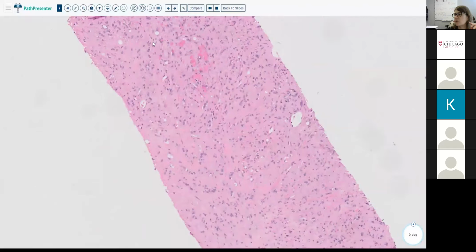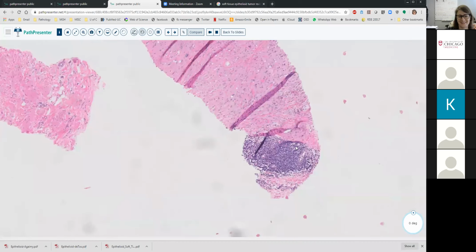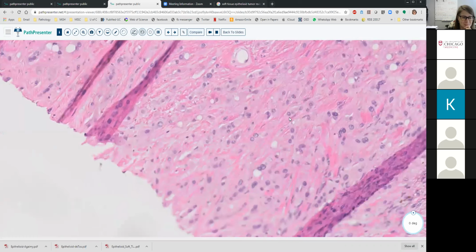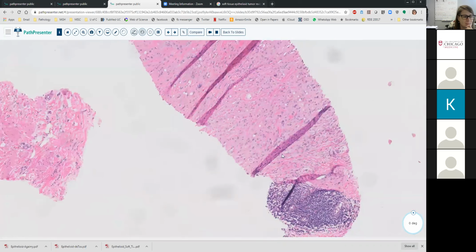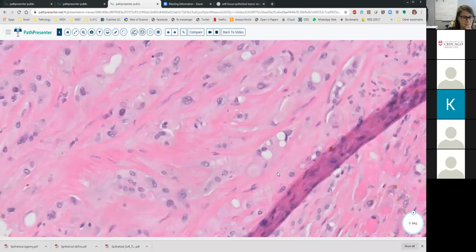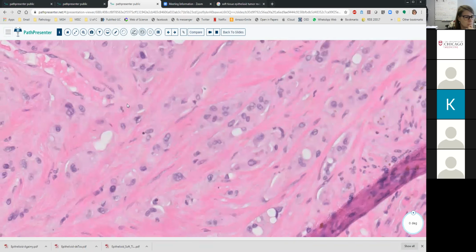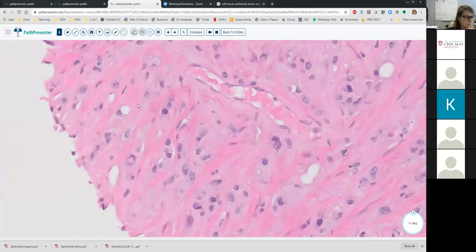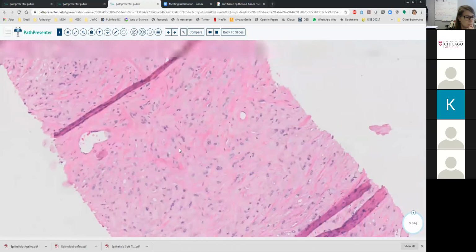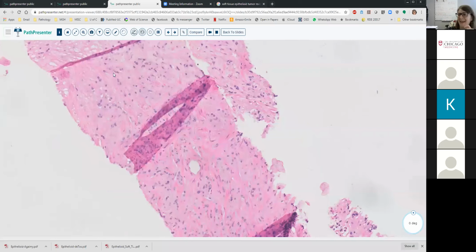How about axillary lymph node? Okay. Actually, I think that's what this was. But either way, if it is a female, you definitely want to work that up in your differential. The cells have indistinct borders, and some of the nuclei are pushed off a little bit by the intracytoplasmic lumina. Overall, I don't appreciate a ton of mitoses. And I think this time you do have the actual diagnosis in the differential on the poll.